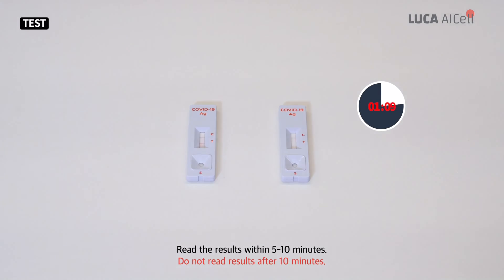Read the results within 5 to 10 minutes. Do not read results after 10 minutes.